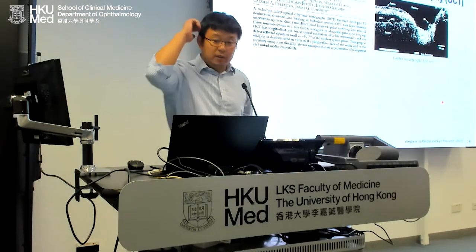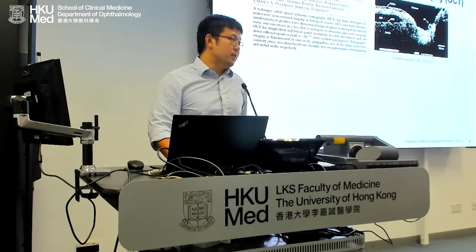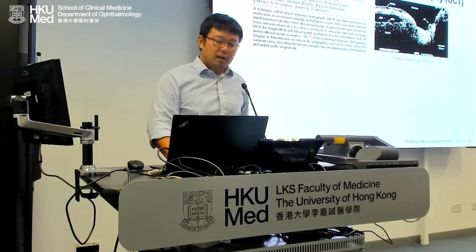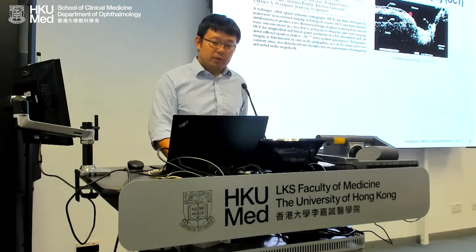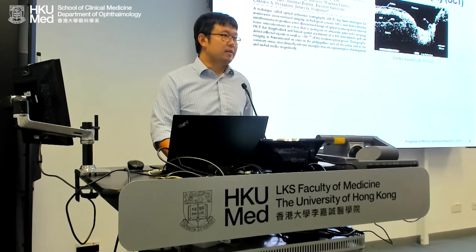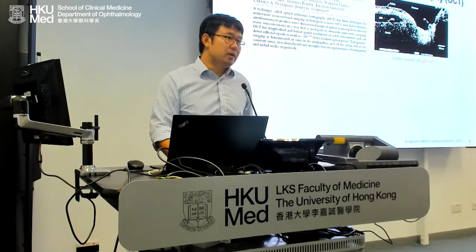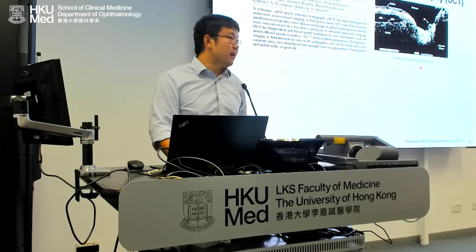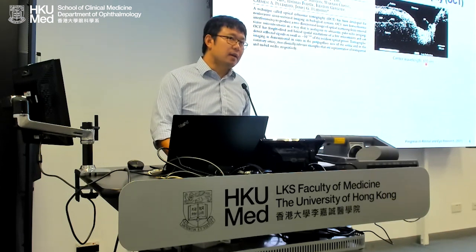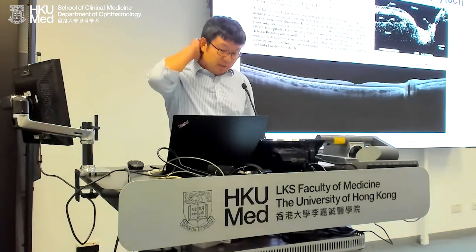A very brief history of OCT. In 1991, a young scientist, David Huang, an MD PhD student at Harvard/MIT, worked with Carmen Puliafito and James Fujimoto. That was his PhD thesis. At the time, that was the quality. I'm sure nobody is going to like it, but it was published in Science, and it's the most cited paper in OCT. At the time, the wavelength was 830 nanometers. The 830 nanometers wasn't selected scientifically. It was whatever was available on the market that they could buy. So there is a historical reason why 830, 840 is the dominant wavelength for current clinical machines. It's because of optical communication. That's why.